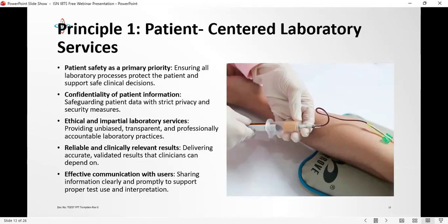By the time they send the person, the first time it happens, the second time they'll say, let me just try them again, and you give the same thing, they will write you off. And you know doctors talk. Results will not give accurate results. Maybe over time, you have been giving them consistent results. It's a new place, you have new instruments, you've not been checking your analyzers. You don't run quality control.